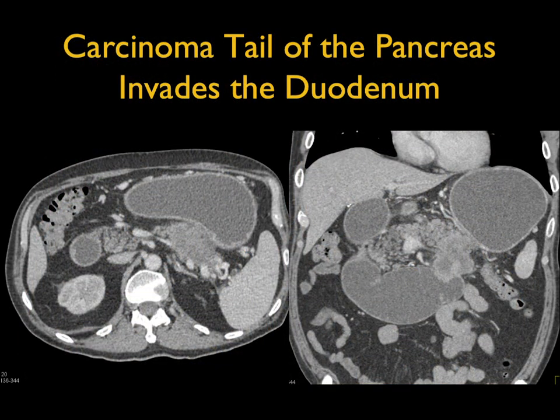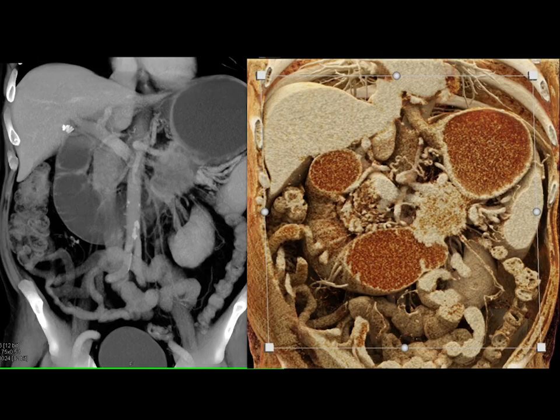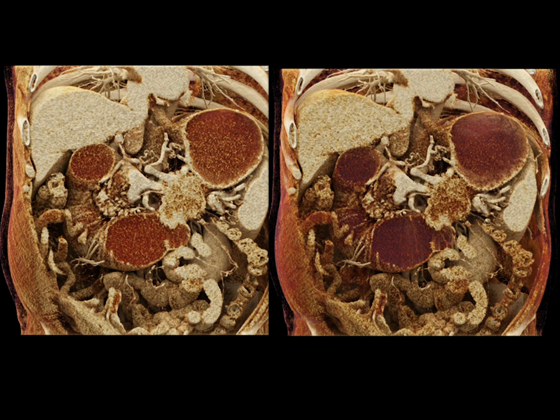Or in this case, pancreatic cancer invading and obstructing the duodenum just past the ligament of Treitz, nicely shown particularly on the 3D reconstructions with volume rendering causing small bowel obstruction. And here it is with the cinematic rendering. Again, you see the mass, you see the fluid of the stomach and the fluid in the duodenum. Some of the distal bowel doesn't have fluid — you can see its different appearance.